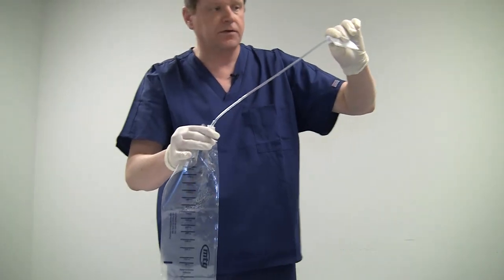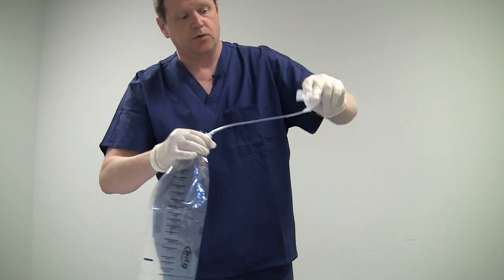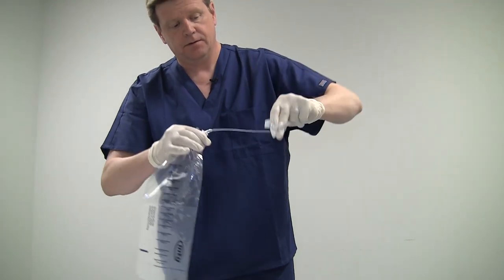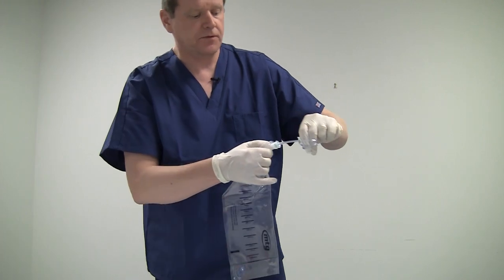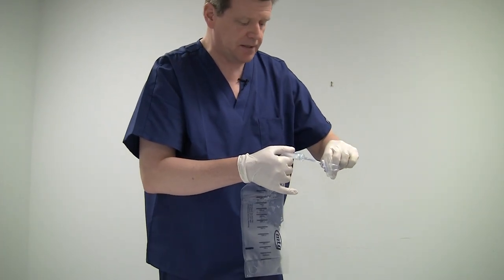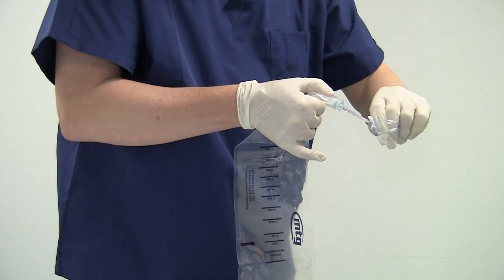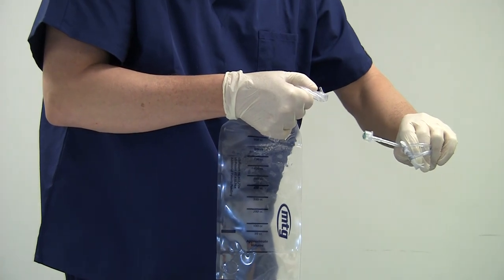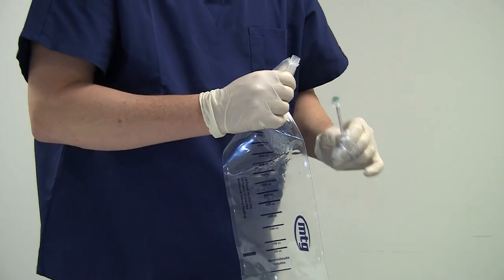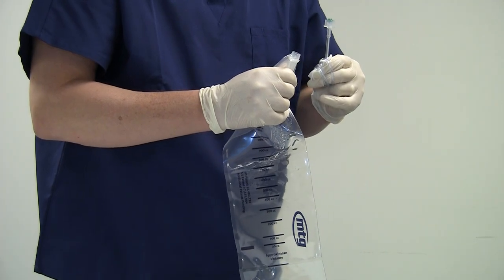Now, we go over to the toilet. How do we get the urine out of the bag? Well, entwine the catheter around the gauze tissue, just like I'm doing here. Go over to the toilet. Now, if we need a sterile sample, this is the other nice trick. Hang onto the pipe inside the bag, and with just a gentle tug here, pull the catheter out the top of the bag and expose the sterile sample port. As long as I don't touch the lip here, the port is sterile and we can pour a sample off for the lab.